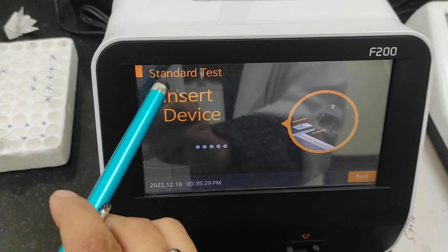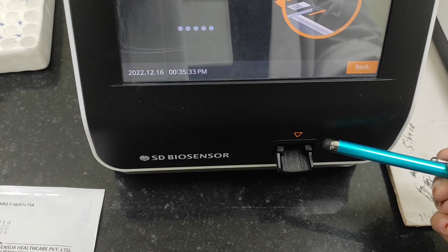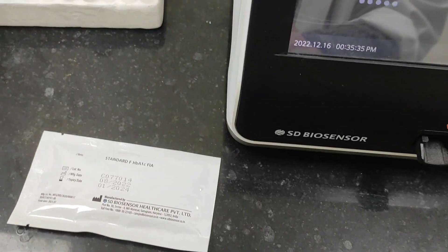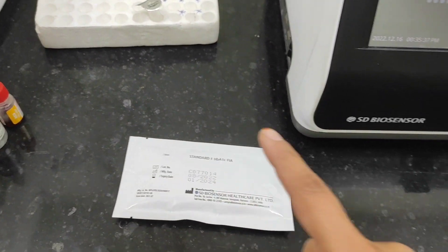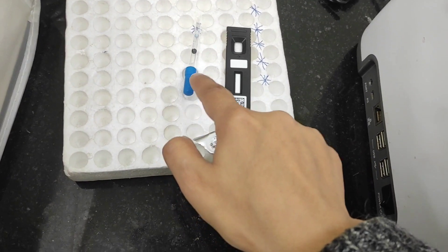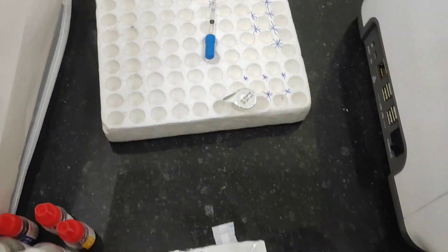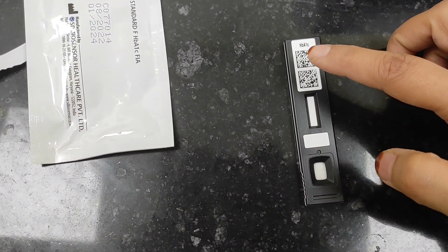Now insert the device. We will insert the device here. This is the card, and as you can see this is the dropper which comes with the card. This is the cartridge, and this here is the barcode.